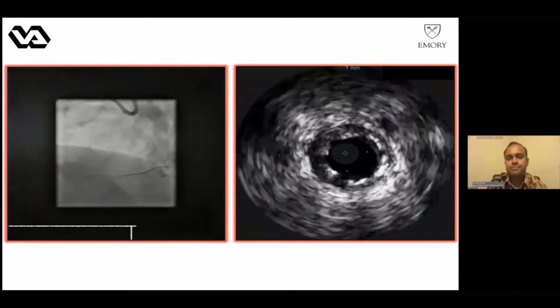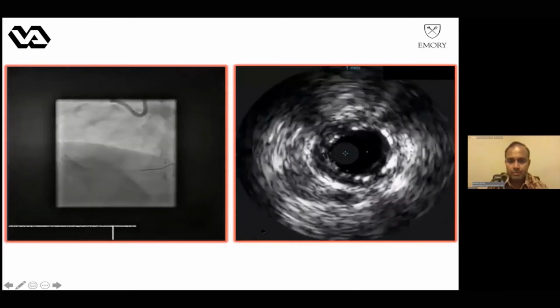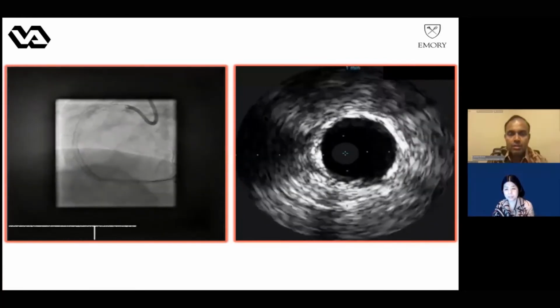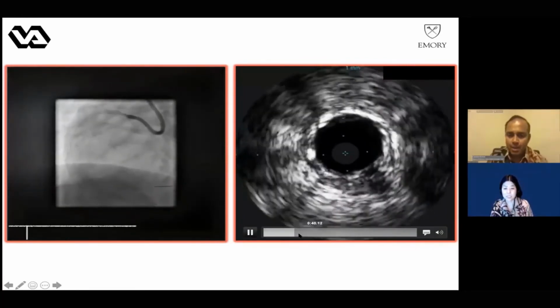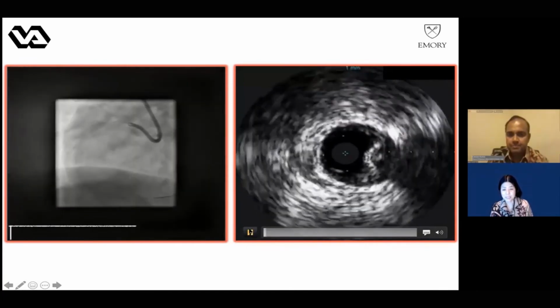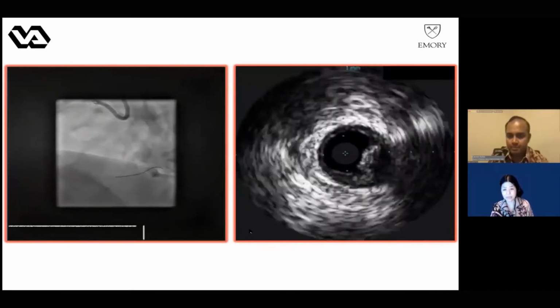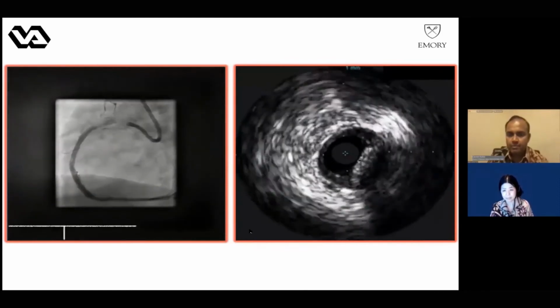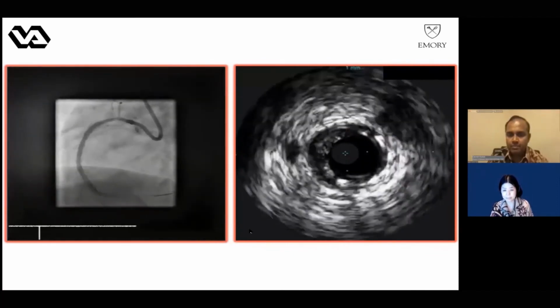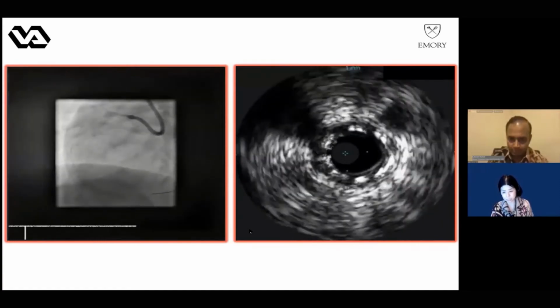Sure. Okay, let me request remote control. I do remote. Okay, so yeah, but I think there is not much explanation. I will start from the beginning again. There you go. So this is distal to the stent. You see a little bit of nodular calcification, but that's okay because the lumen is good enough. And then this is a relatively normal segment. First, you have to check there is no edge dissection. There is no dissection, that's good.